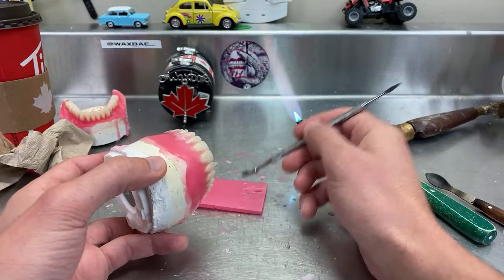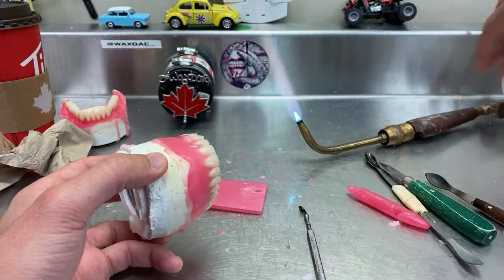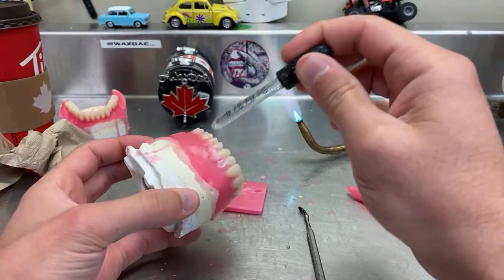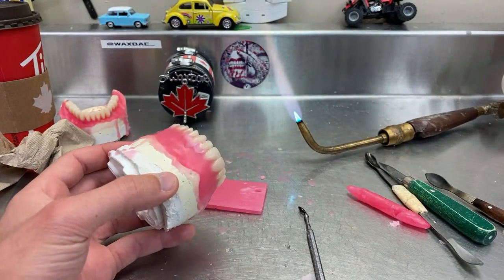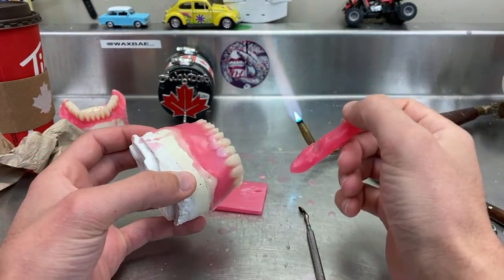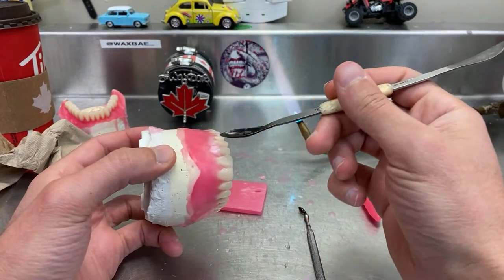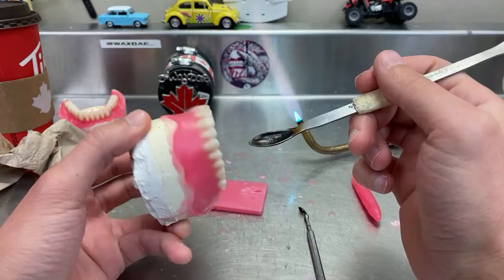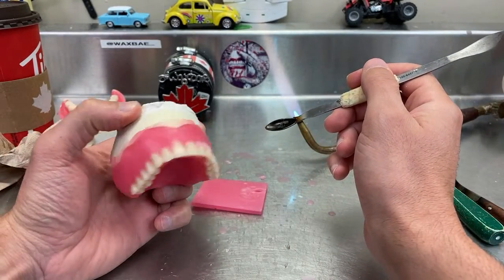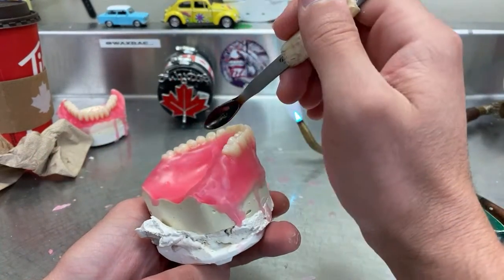If you don't have this instrument, as I said, you can use the eyedropper, the glass dropper, like this. You heat up the wax and you suck it in and then you drop it. I don't like to use that. You can use this and just add it, but make sure you don't touch the wax. Okay, I'll try with this one. See where it needs it. Well, maybe here. It's a little short.